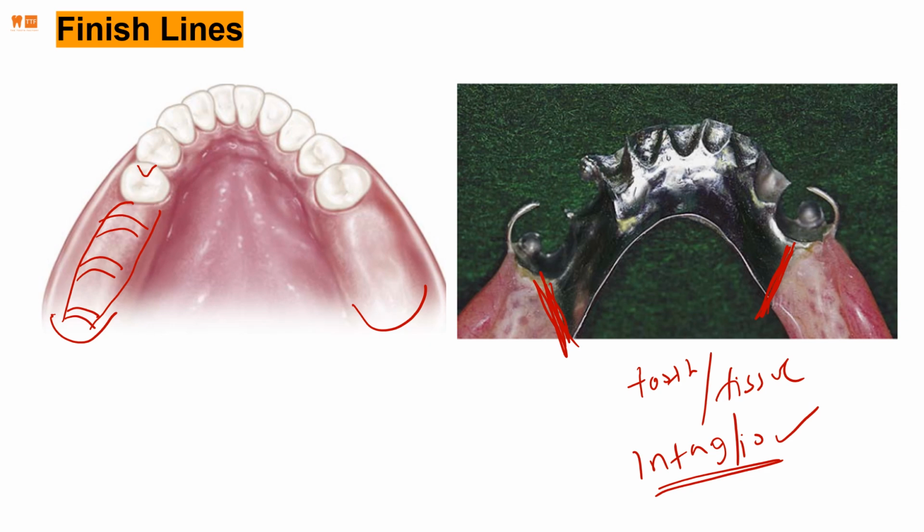Ooh, that's a terrible plate. Proximal plate kind of comes off like this. And then a bar type I bar comes out of like that. Actually comes out of the denture base, but okay. And then there's a minor connector that connects all of this. This is just an example, of course. Right, and it does the same thing here.